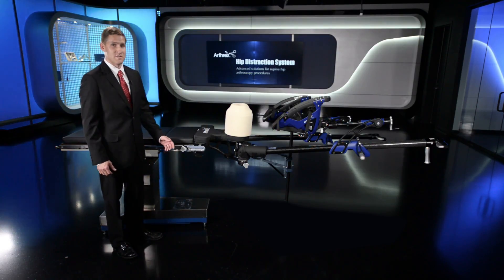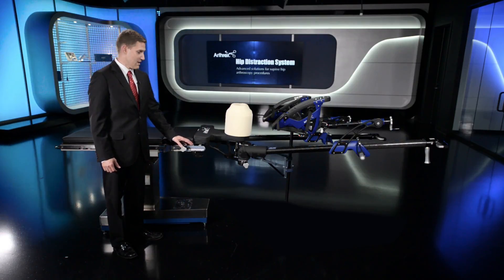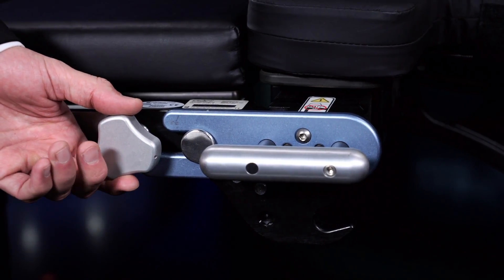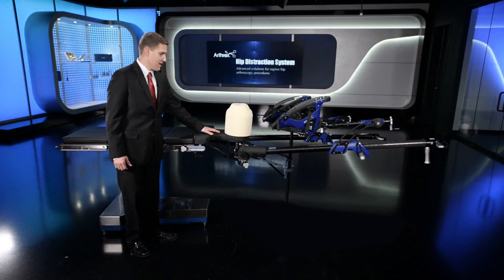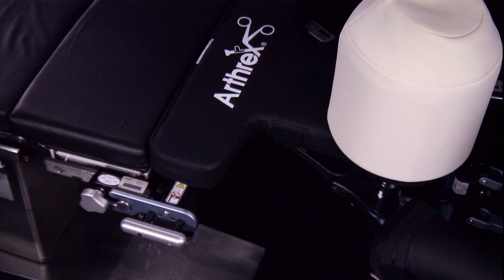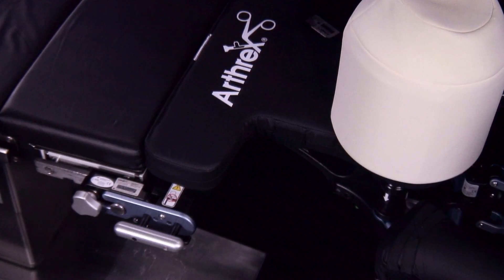The Arthrex hip distraction system will attach via Clark rails through these Clark rail adapters on each side of the table. The well padded patient platform attaches to those adapters and there's a cutout on the operative side to allow the C-arm to always get a nice shot of the hip joint.